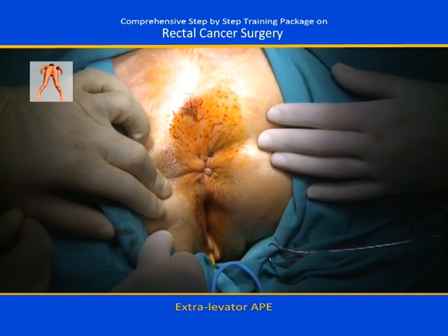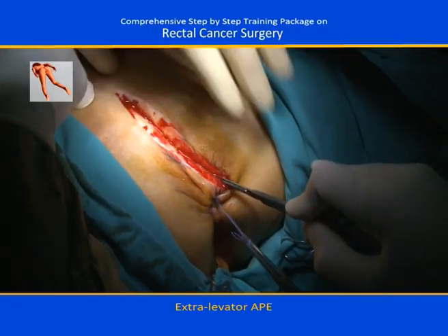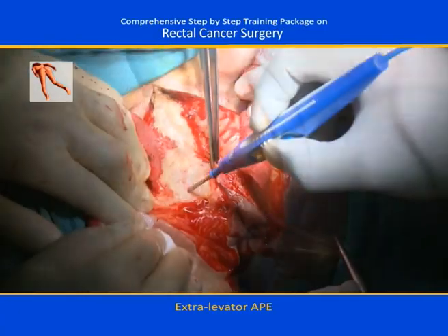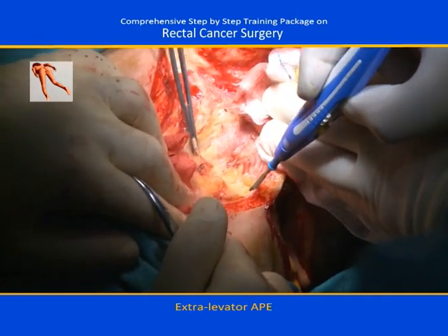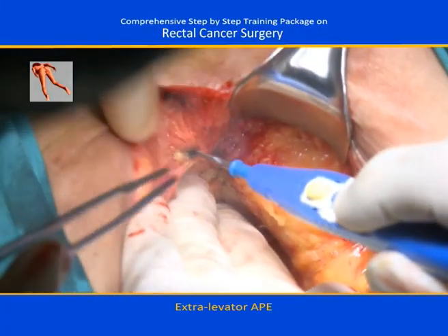In this case, the tumor is located in the anterior part of the rectum, 2 cm above the dentate line. Surgical incision from coccyx to labium is performed around the anus. As was demonstrated in the male patient previously, the dissection planes are the same. Dissection is continued just outside the external anal sphincter and then carried out between the ischioanal fat tissue and the levator muscles.